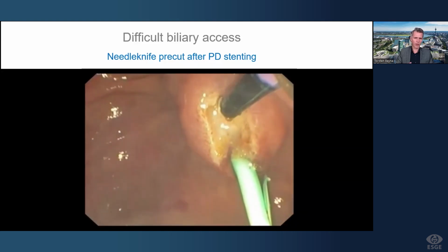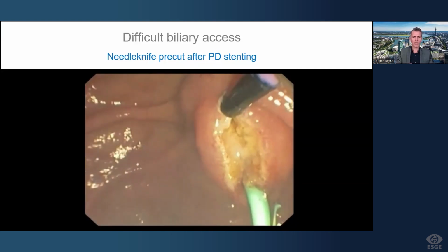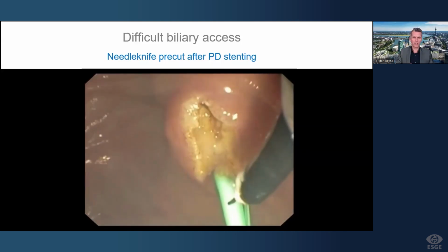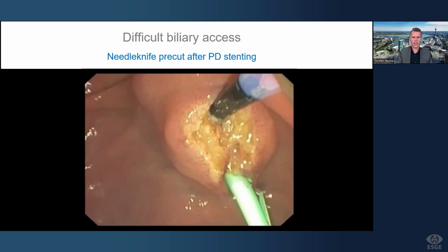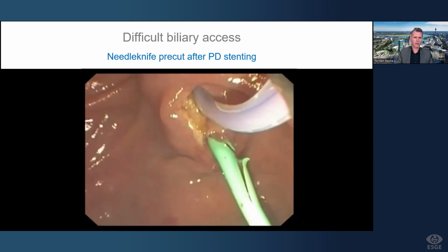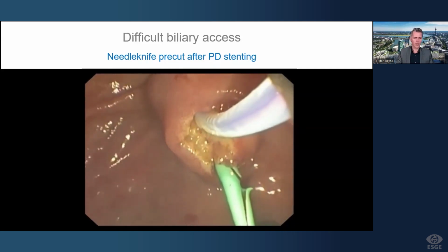So the red spot is maybe the orifice. One more cut. Sometimes we can already see bile coming from the CBD here at that stage, and then we just remove the needle from the catheter, and we can cannulate here into the biliary direction and complete the procedure.